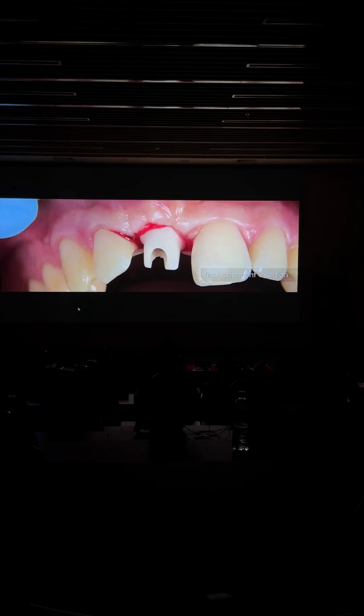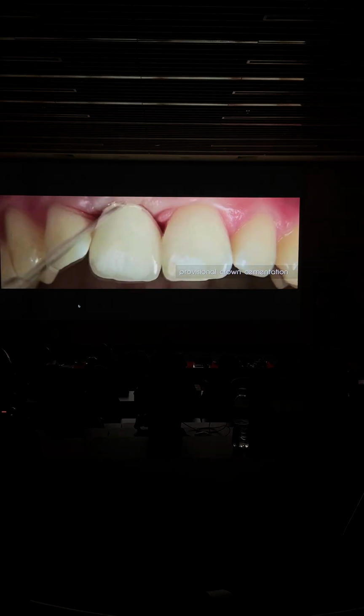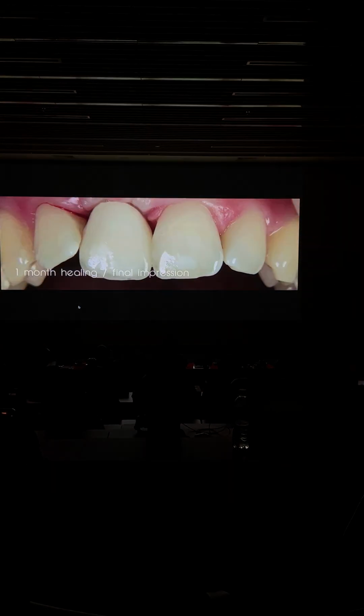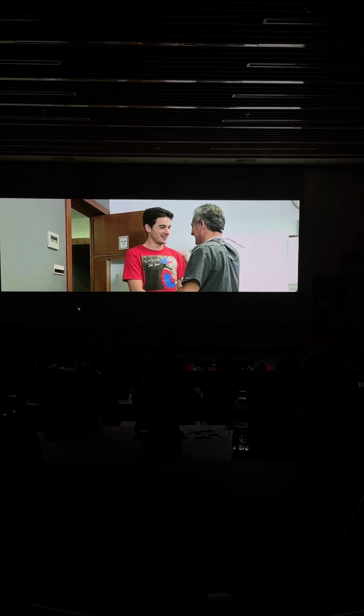It can be applied to any type of restoration. And you can see good contact point. The patient leaves, comes back 1 month later to take final impression. Today he's a doctor, he's a traumatologist.